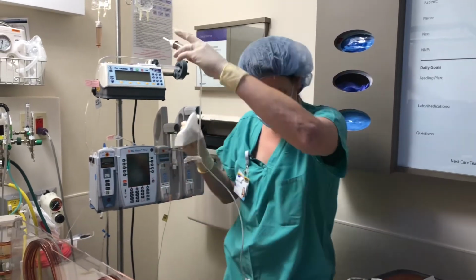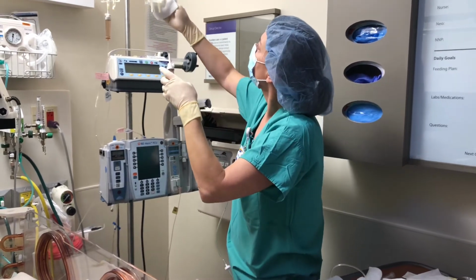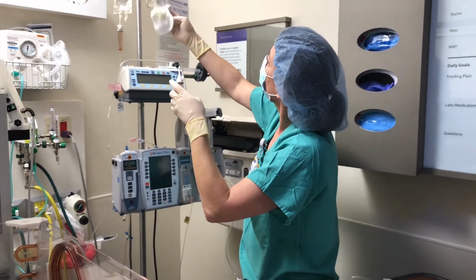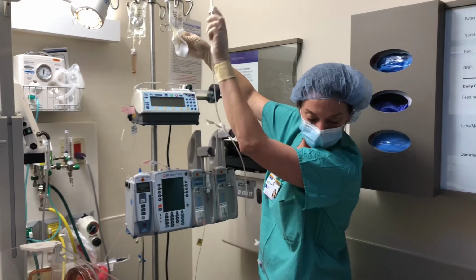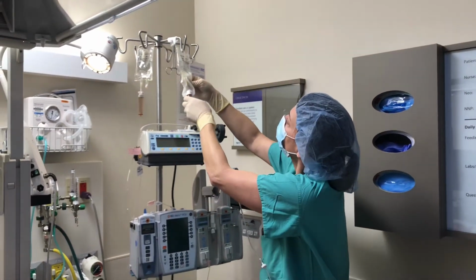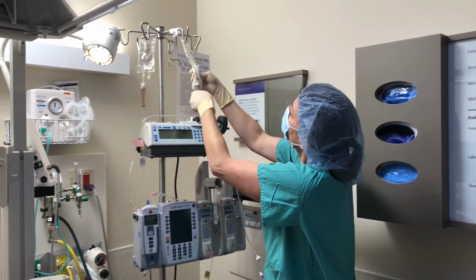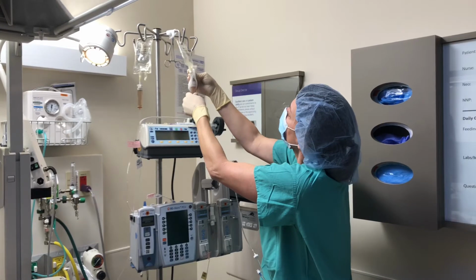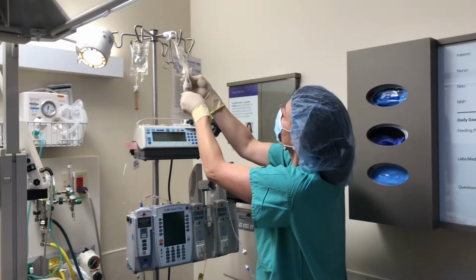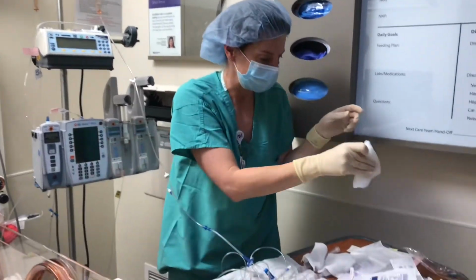Kind of get this out. I may need to move my table a little bit with my foot there. Okay, so then I can grab my bag, make sure I'm not going to lose anything, and then I can spike my bag. Okay, and fill my drip chamber half full. Okay, and then my tubing is connected there.